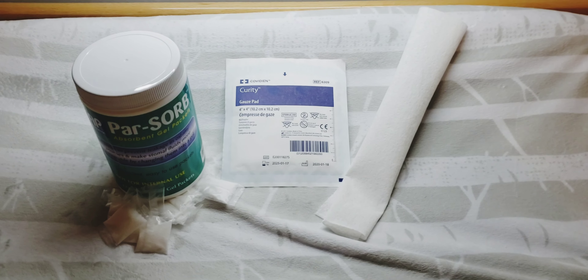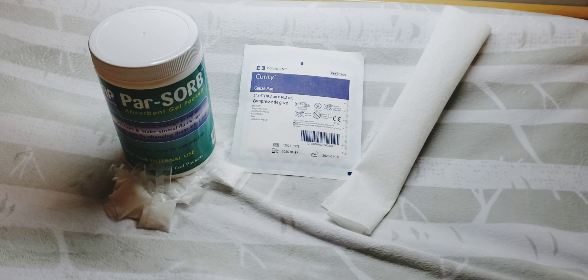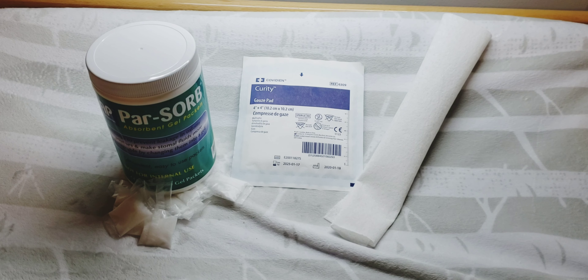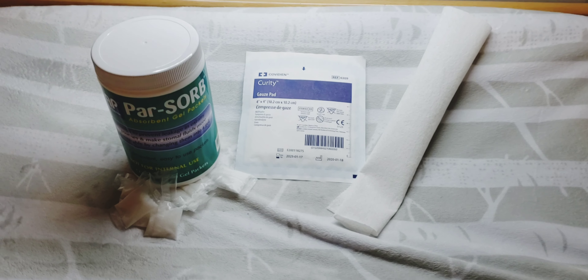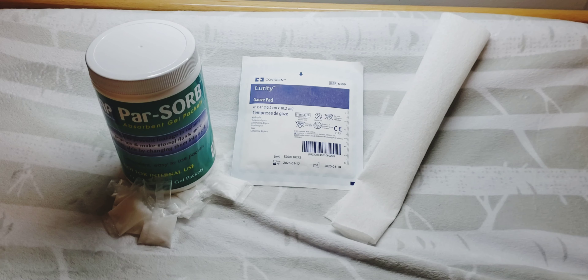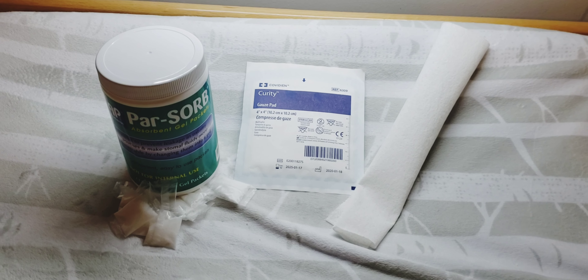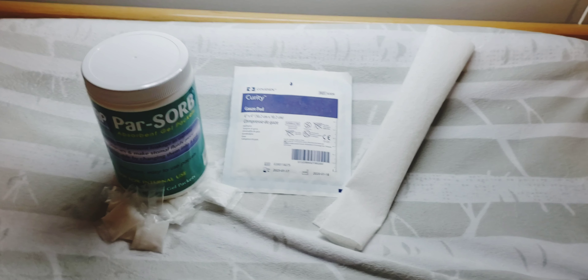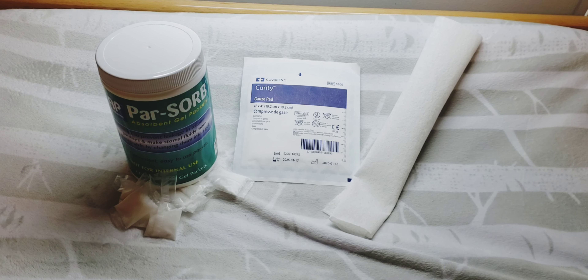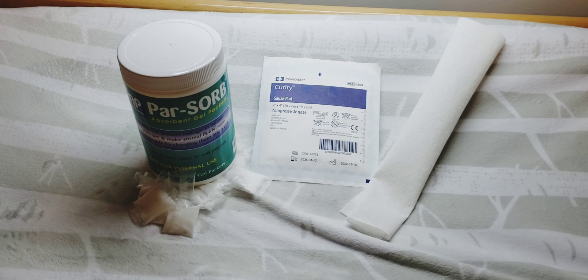I say I used to do that because my baby had his reversal — yay! — and I'm not going to be needing this anymore, ever again hopefully. That's the plan. So these are some great ways to prevent leaks from your bag, or just if he's watery and it's hard to empty the bag because it's so watery. These can help with that too.